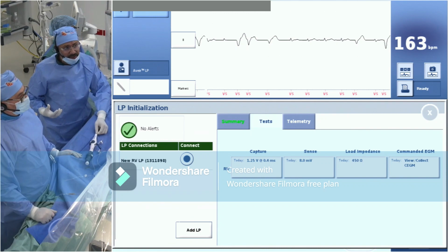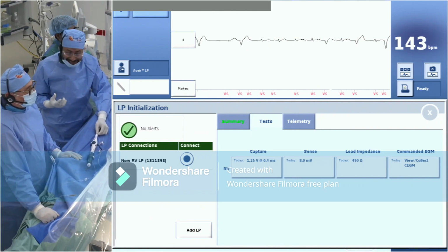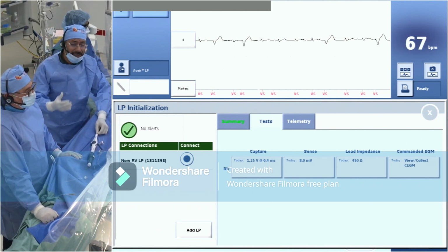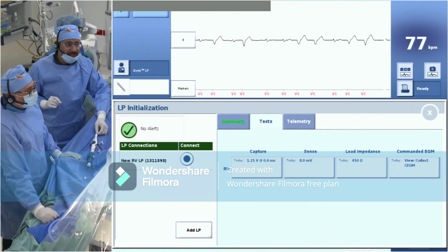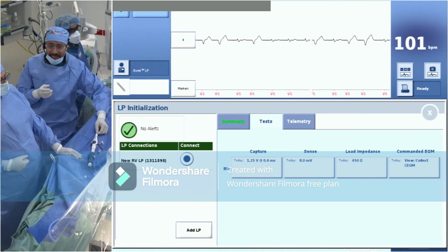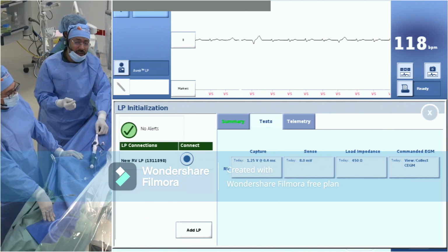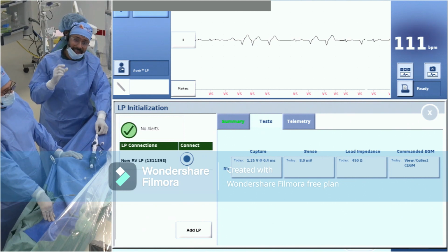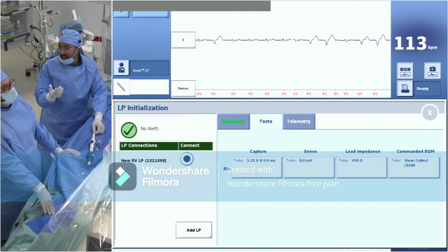As I told you, we have multiple trials, even coming from the UK lately, comparing patients above 75 with VVI or DDD pacemaker, with a 5-year follow-up, and it didn't make any difference regarding the ejection fraction. The trial that you're referring to, I think it's good that we have Dr. Walid from Cleveland Clinic. It comes from his center, because they mentioned the incidence is less than 12% after 5 years. So we are putting it in an elderly population and we follow them up, but having an upgradable technology is a great add-on.